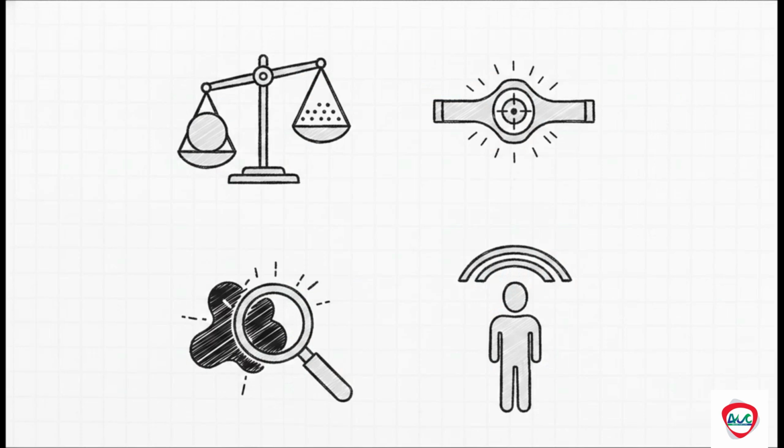All right, let's wrap this up and summarize the key takeaways from today's explainer. Number 1, choosing your frequency is always going to be a strict compromise between fine detail and deep penetration. Number 2, adjusting your focal zone is the #1 way you improve your lateral resolution. Number 3, those weird shadows and bright spots, they're artifacts handing you crucial diagnostic context. And finally, practicing ALARA keeps your patients safe while you investigate.